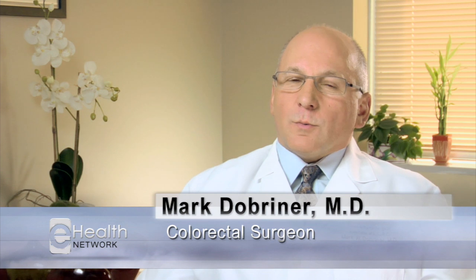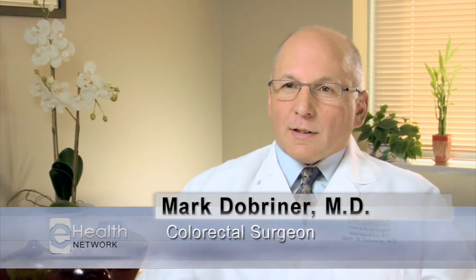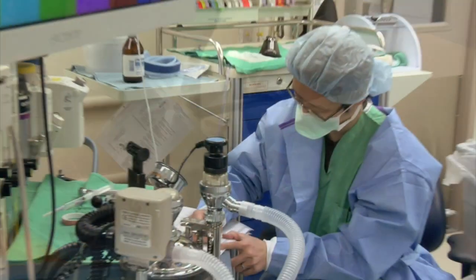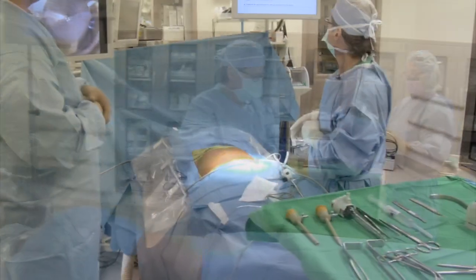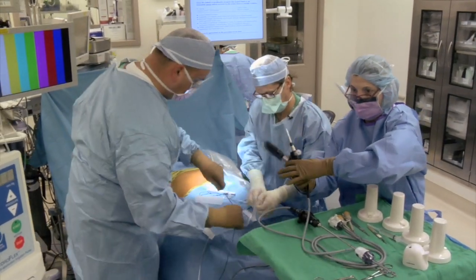Laparoscopic surgery is another name for minimally invasive surgery. And the difference between full-blown laparotomy and laparoscopy is that laparotomy usually requires a fairly large incision in the abdomen. Laparoscopy, or minimally invasive surgery of the abdomen, allows us to do the same surgeries we would do through a laparotomy, but through much smaller incisions. In my particular practice, which is limited to colon and rectal surgical issues, I'd say at least 80 to 85% of my abdominal surgery is at least started laparoscopically.